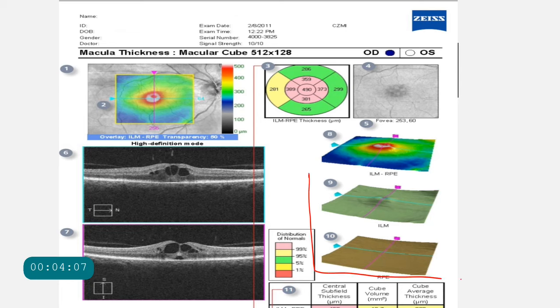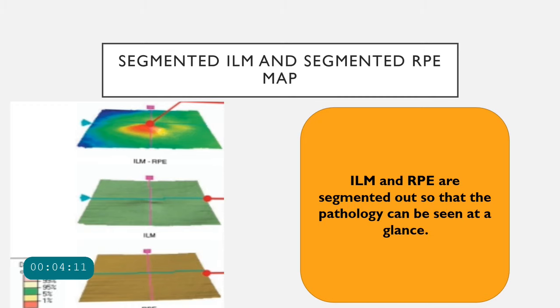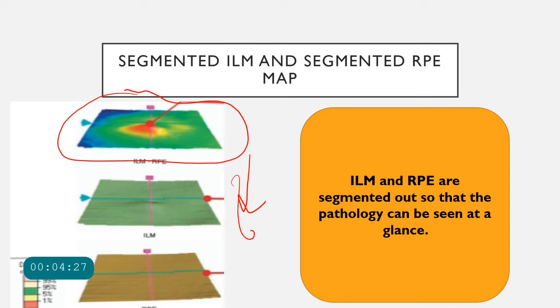After the 3D map, we have the segmented ILM and segmented RPE map. These two segmented images provide a 3D view of the internal limiting membrane and the retinal pigment epithelium respectively. Any pathology in the ILM or RPE can be seen at a glance. For example, if drusens are present — which sit below the RPE — you can see elevations or bumps on the RPE segmented map. Similarly, any problem in the ILM can also be seen on the ILM segmented map.